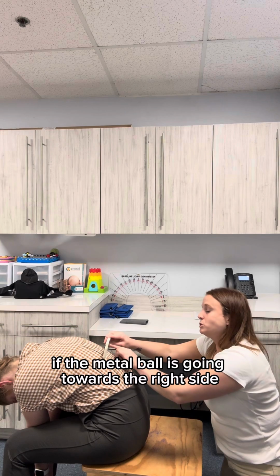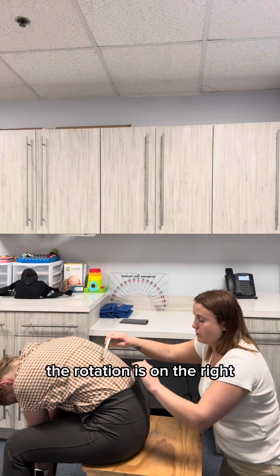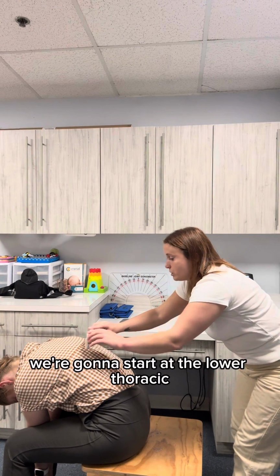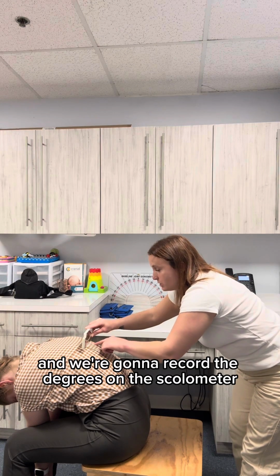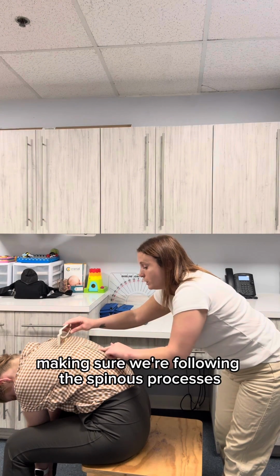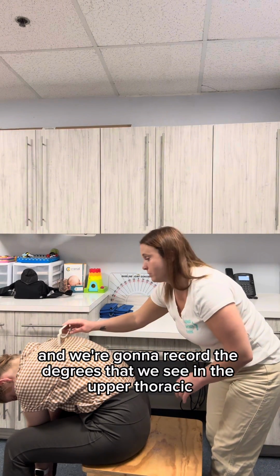If the metal ball is going towards the right side, that means the rotation is to the left. If the metal ball is going to the left, the rotation is on the right. We're going to go ahead and move up to the thoracic spine. We're going to start at the lower thoracic, and we're going to record the degrees on the scoliometer. We're going to move up to the upper thoracic, making sure we're following the spinous processes. And we're going to record the degrees that we see in the upper thoracic.